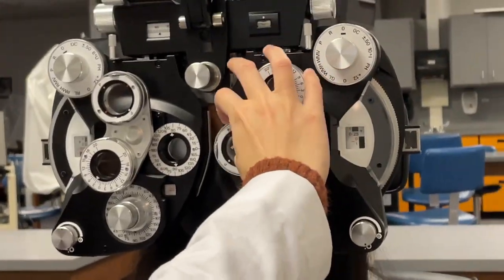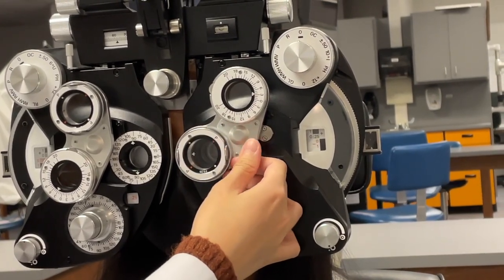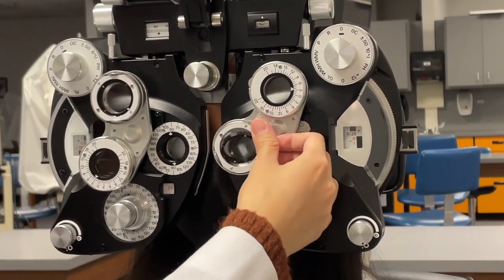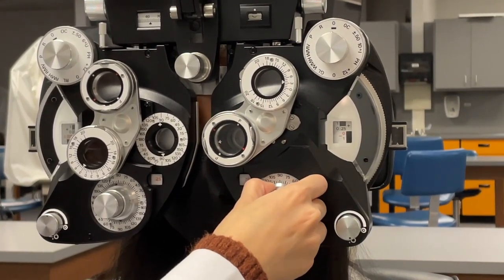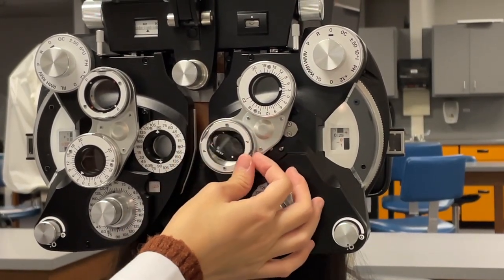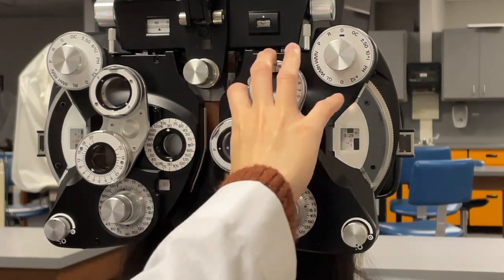All right, Mrs. Lee, do you see the line right there? Yes. Okay, so I'm going to give you 2 options. Which one looks sharper and clearer to you? 1 right here or 2? 1. 1 or 2? 1. 1 or 2? Same. Good. And then 1 right here or 2? 2. 1 or 2? Same. Good.